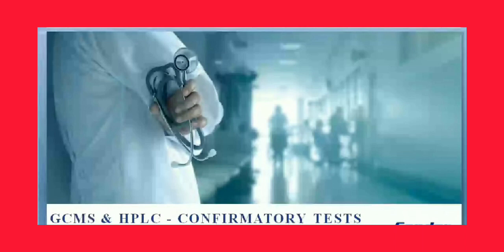Today, I just want to give you a very brief overview of confirmatory tests. That's the reason I was asking what you understood and remember from the previous sessions on newborn screening. This is just a continuation of screening. Once the screening is done, we recommend confirmation. These confirmatory tests are recommended if there is an abnormality in the screening, and this is only for metabolites, that is 49 disorders and beyond that. Here we use HPLC and GCMS instruments for the confirmatory tests.